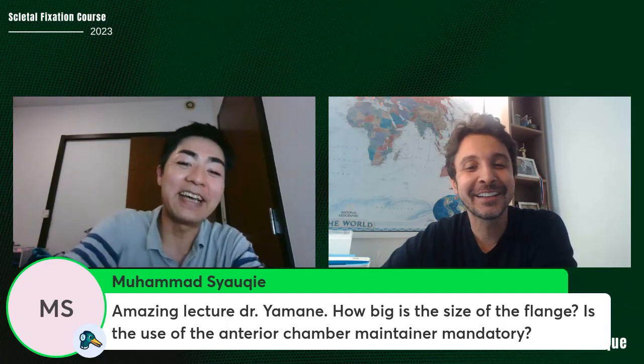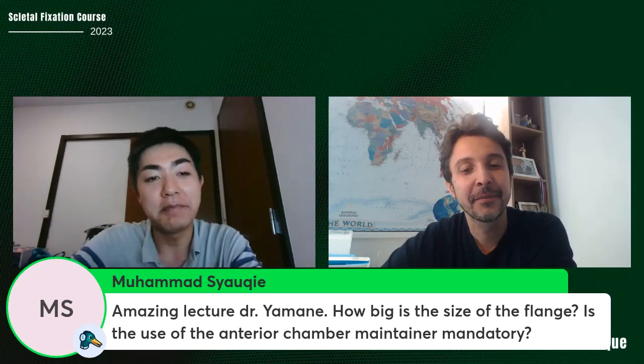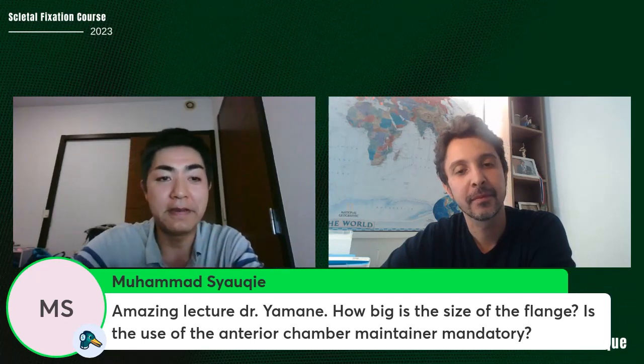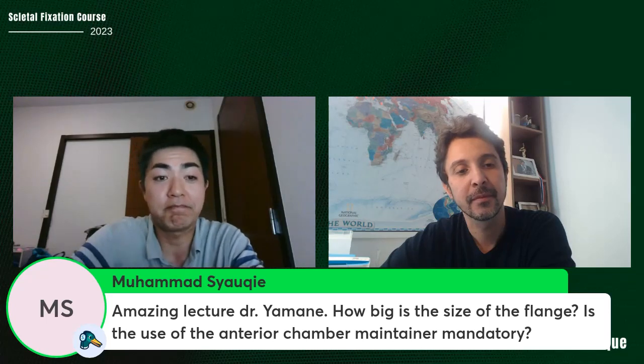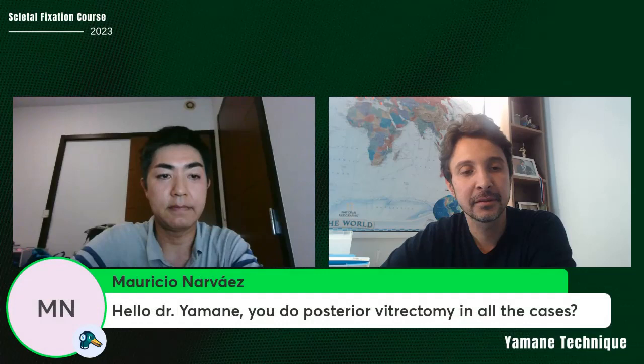Okay. And next, AC maintainer is a good choice, but I am a vitreoretinal surgeon, so the infusion port is better for me. Next question, please.